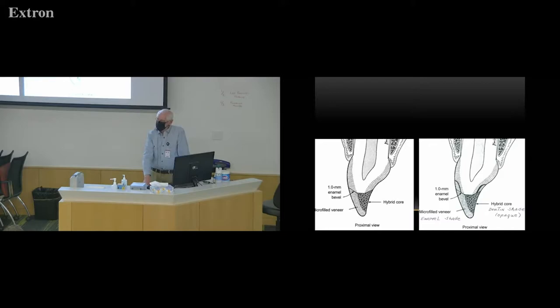Now, do you guys know what a chamfer is? That's because you haven't had fixed prosthodontics yet. In fixed prosthodontics, you're going to be cutting crown preparations, and this is the way you're going to be finishing those, with a chamfer. So you're going to be introduced to that right now. Next semester, you'll be in fixed prosthodontics and you'll be cutting these. So you're getting an introduction.